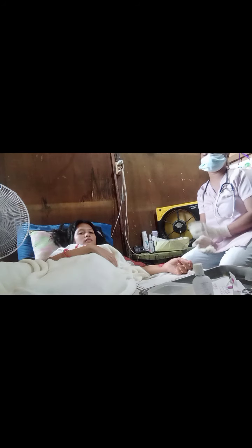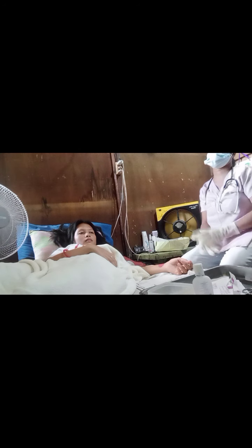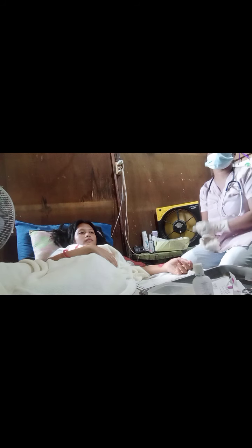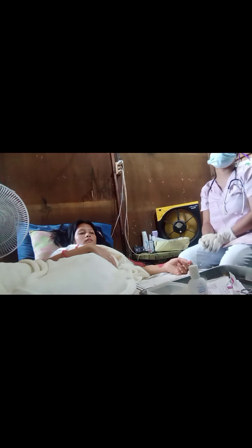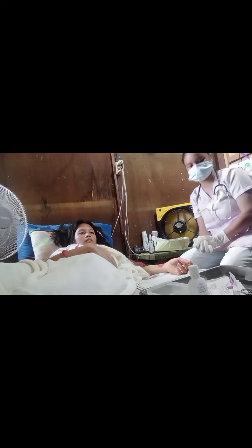Now I'm going to proceed with the wet to dry dressing. So for the wet dressing, I'm going to pour the prescribed solution on the kidney basin. Then this is the time that I'm going to add a fine gauze.